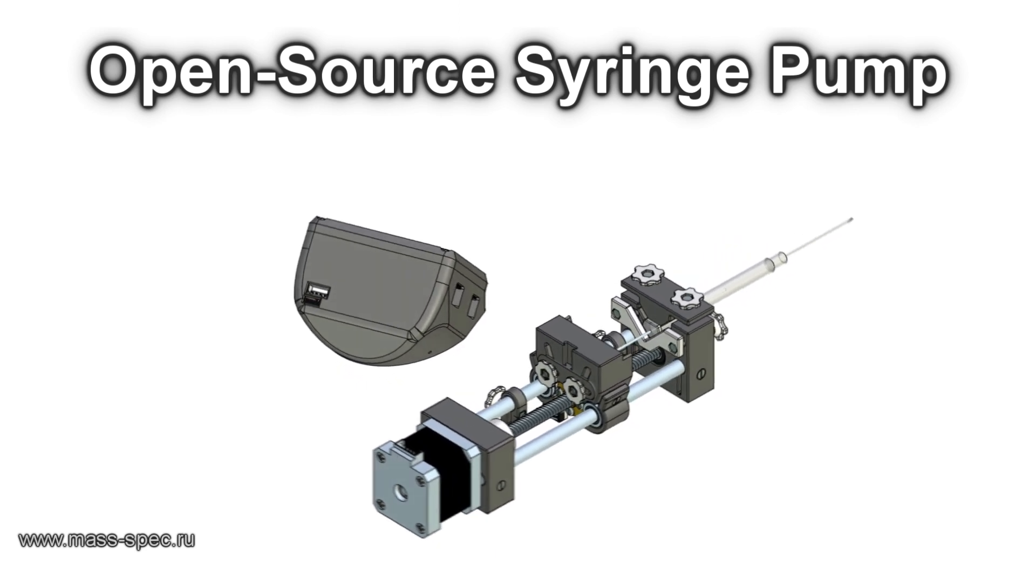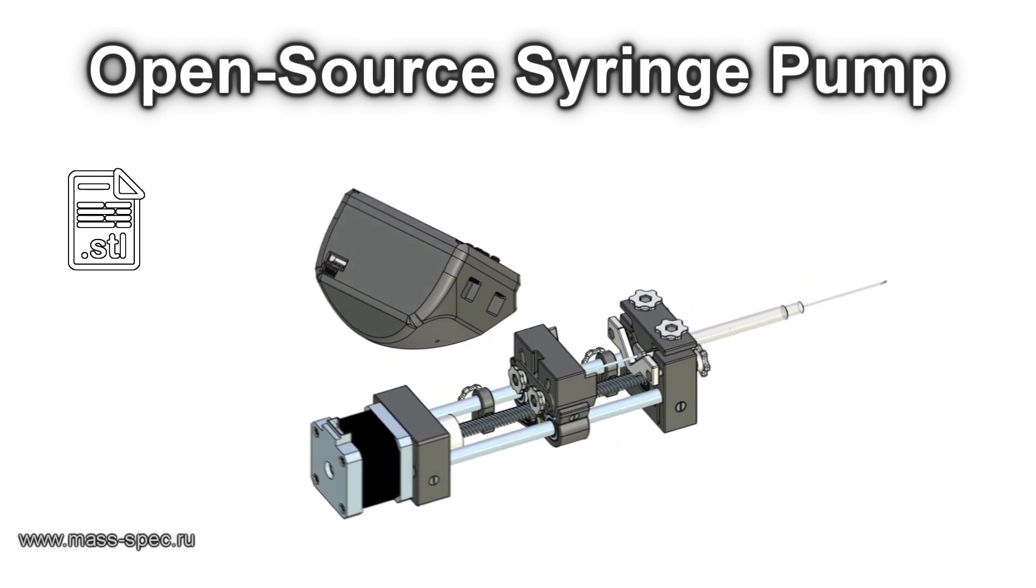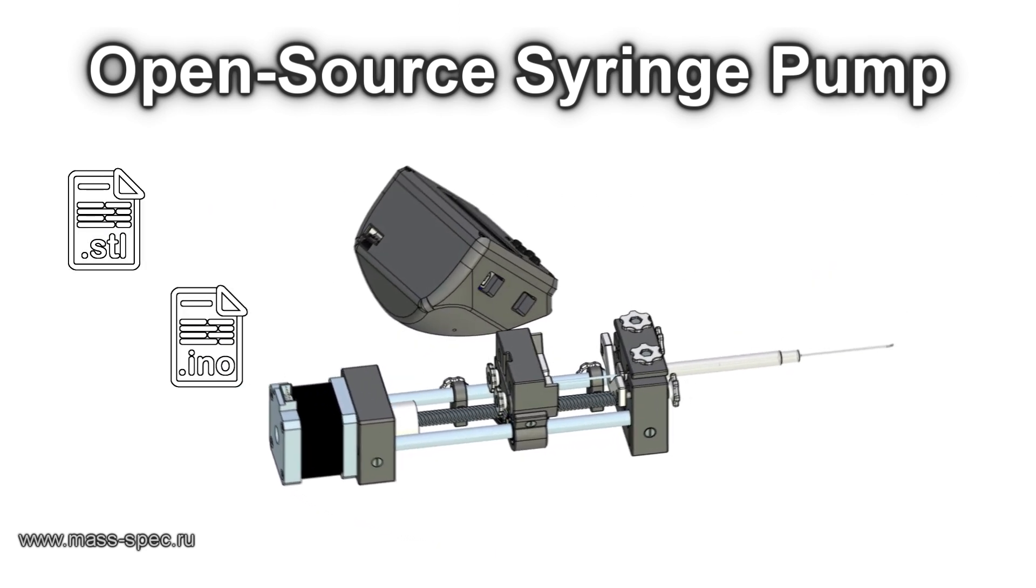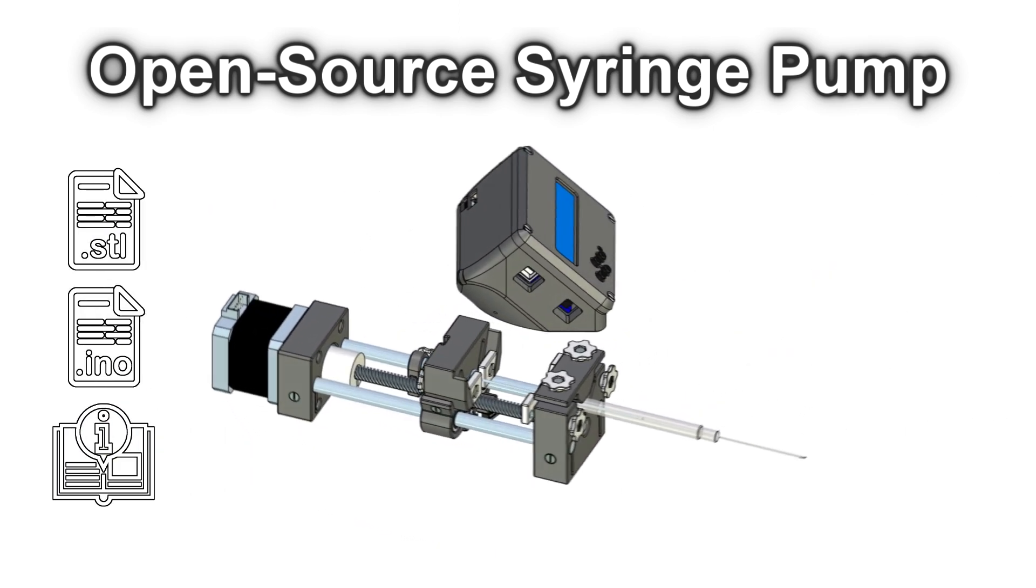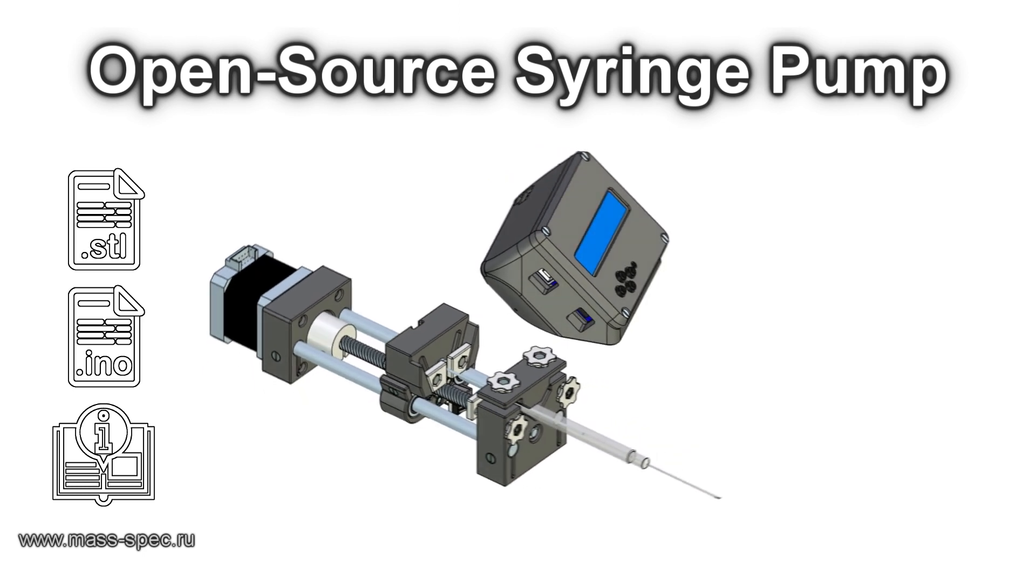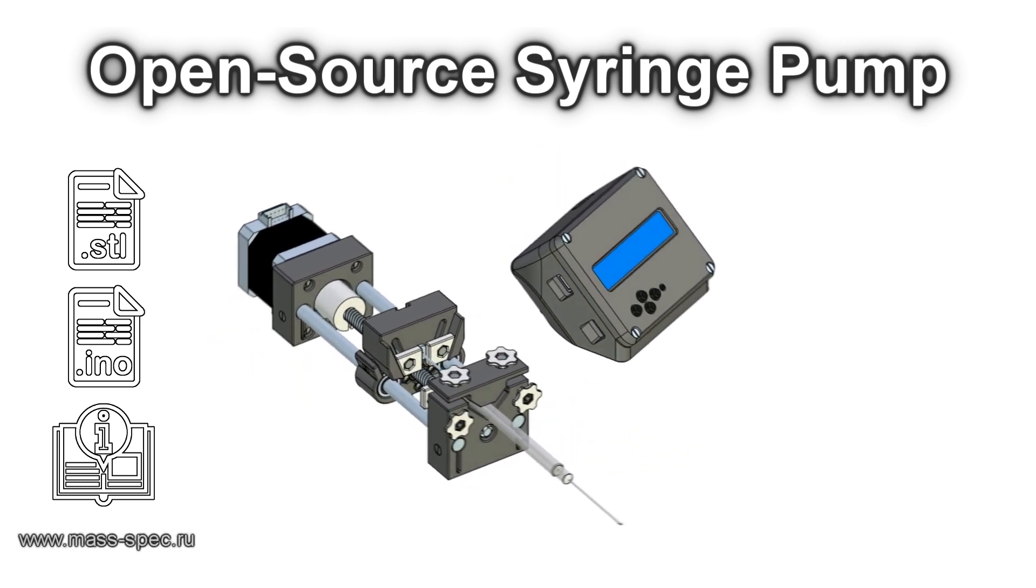STL files, Arduino sketch, assembly and operating instructions are available on the website of our scientific group.